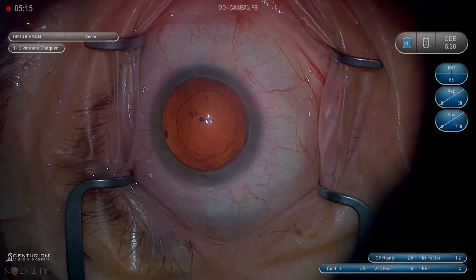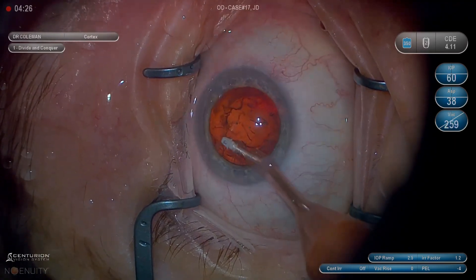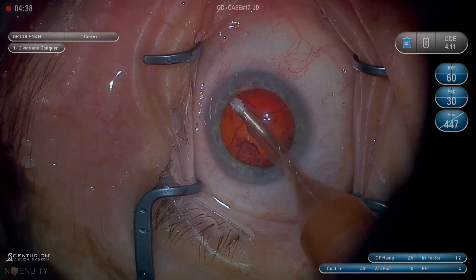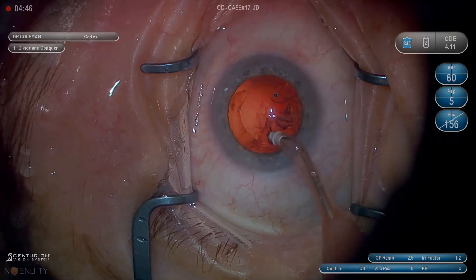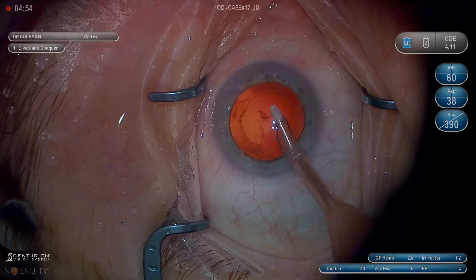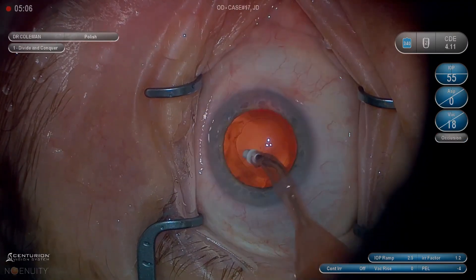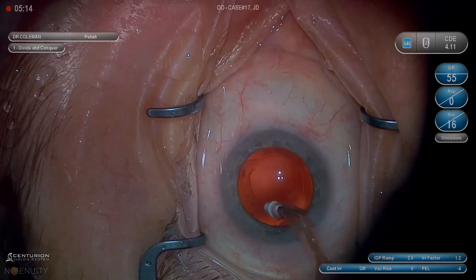In the nucleus video I talked a lot about taking the nucleus in quarters, and I'm a big proponent of that — and also of going fast when you're in a safe position and slowing down when things are more risky. Cortex is exactly the same. My plan when going in to start the cortex is basically to take it in quarters. I want to move in an arc and engage a big swath of cortex, not take it in little pizza-pie slices one at a time. There are a few reasons for that: number one, it's faster; number two, it's safer; number three, it gives you less tension on the zonules.